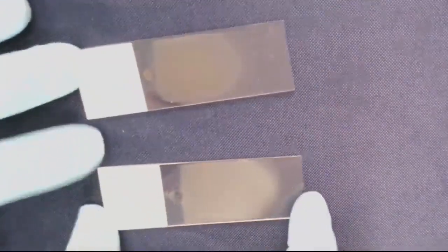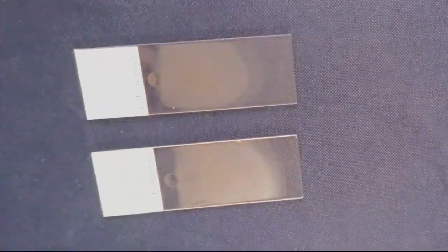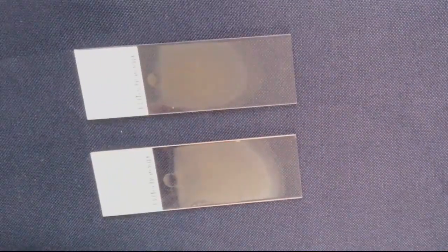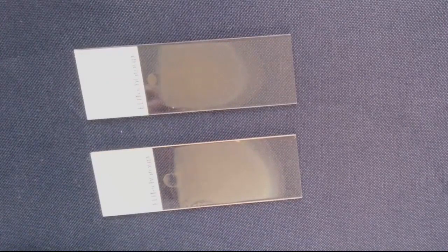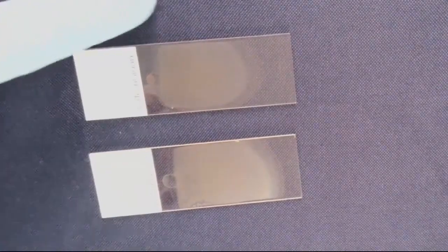Here are a couple of examples of good but not perfect slides. You can see how the blood went all the way from the top to the bottom across the width of the slide, and there's even, consistent pressure as the blood is pushed across. There is good, even monolayer, and these slides should give great staining results.